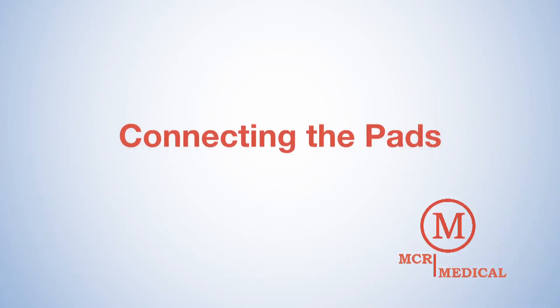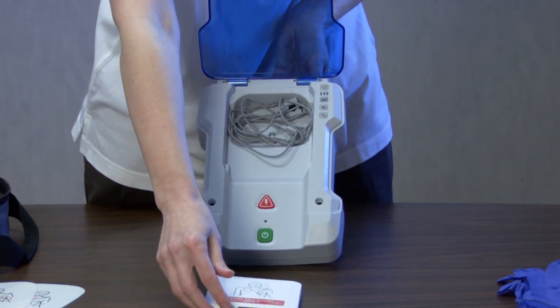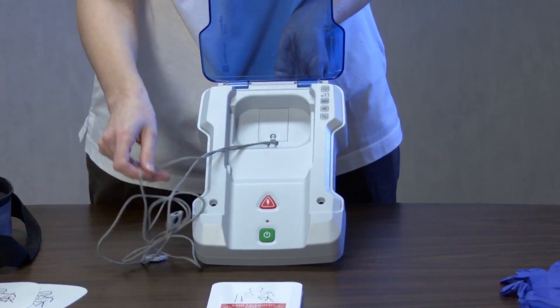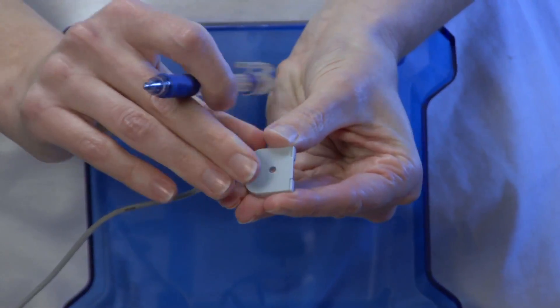Now we'll connect the AED Training pads to the unit. To connect the pads, find the ends of the AED Trainer cables that are not connected to the unit. Remove the black pad connector pins by pushing on the small end of the pin with a ballpoint pen.